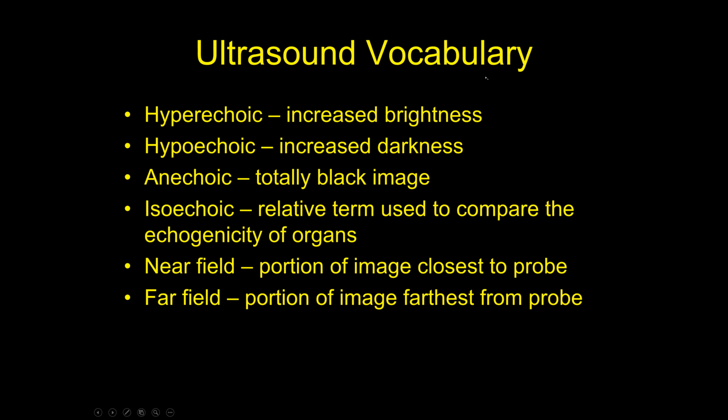Okay, then we're going to move on and talk about a couple of definitions, just so we're all on the same page. Something described as being hyperechoic: let's imagine you have a nodule inside the liver and you see it with your ultrasound machine. If that nodule shows up bright white, you say that nodule is hyperechoic, meaning literally echoes of sound and hyper, so too many echoes. It shows up bright white.